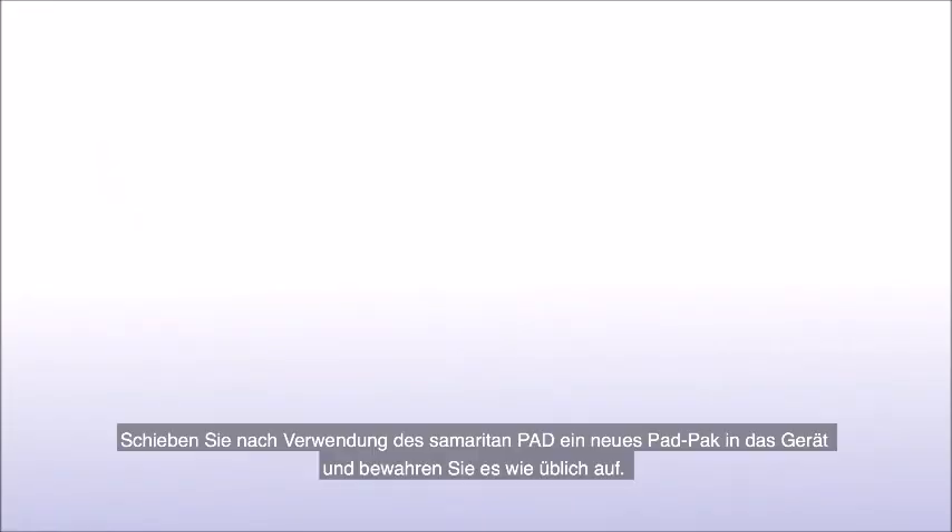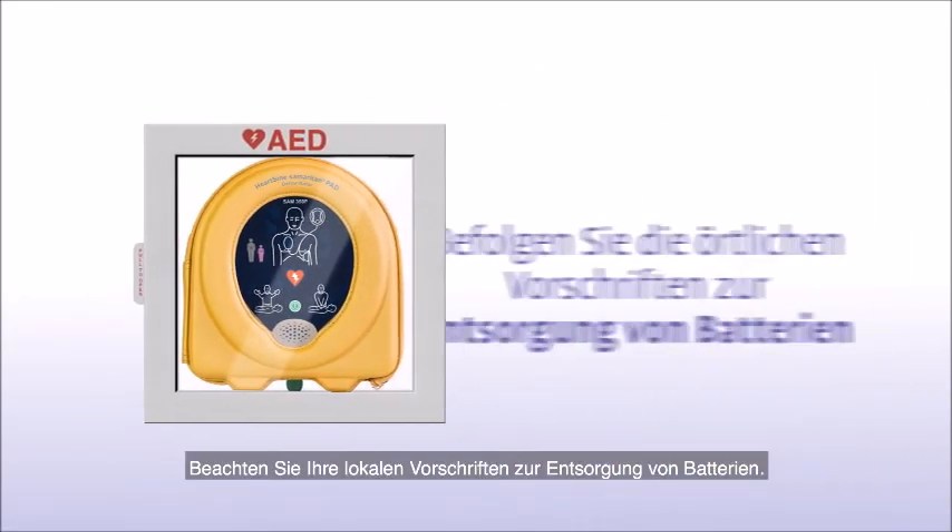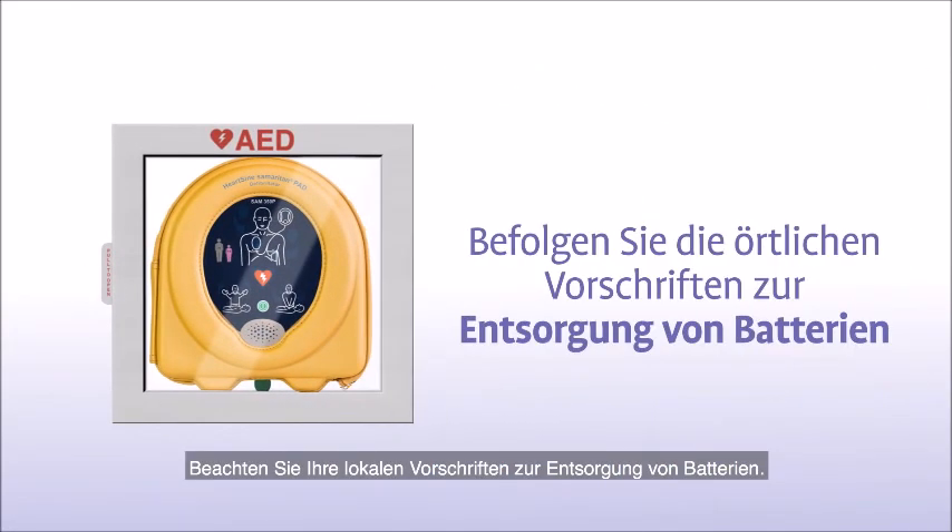After using the Samaritan PAD, slide a new pad pack into the unit and store it as usual. Remember to follow your local battery disposal guidelines.